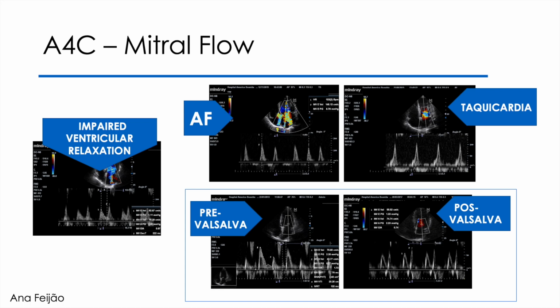Don't forget one thing, the duration of the A wave is an important parameter in the assessment of diastolic function, often leading to a tiebreaker of opinions. But contrary to what many think, it should be evaluated with the PW cursor sample at the level of the mitral annulus and not in front of the leaflets, where we place a sample to evaluate transmitral flow.